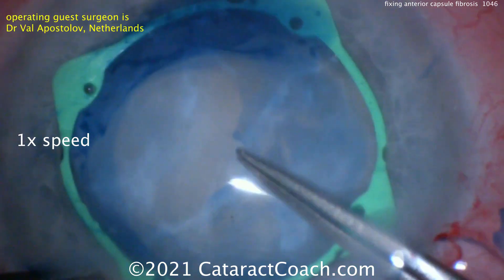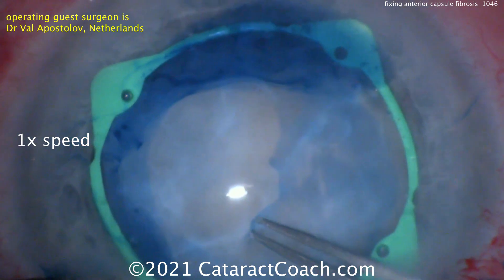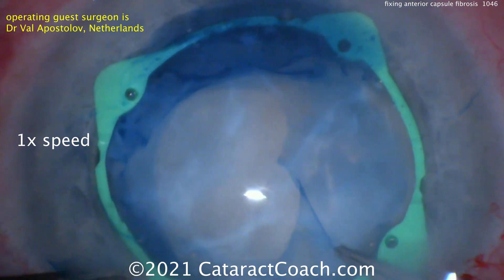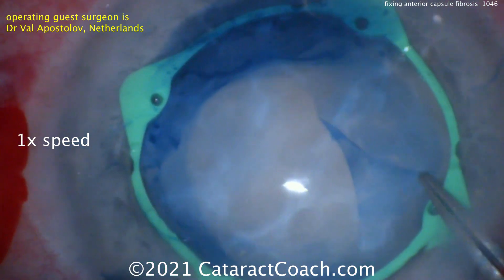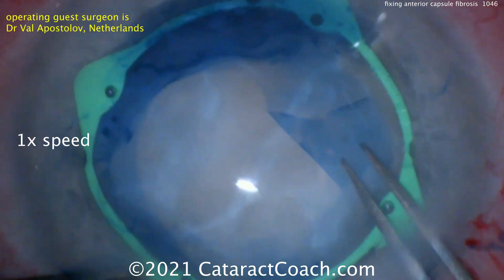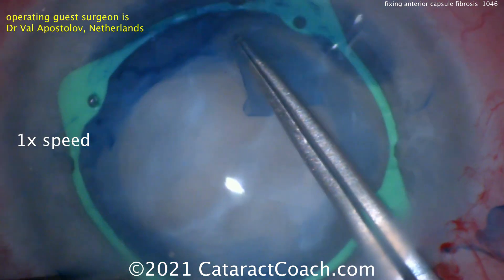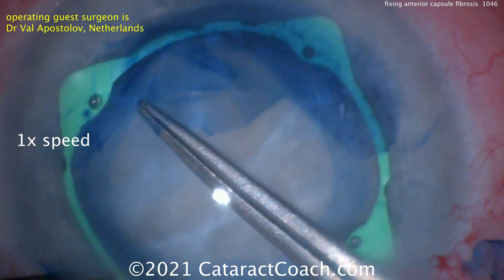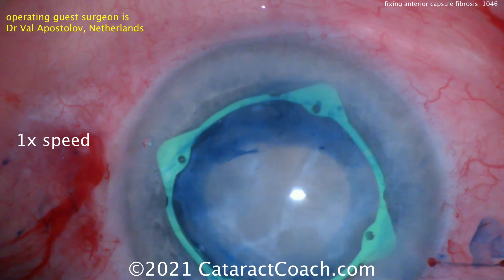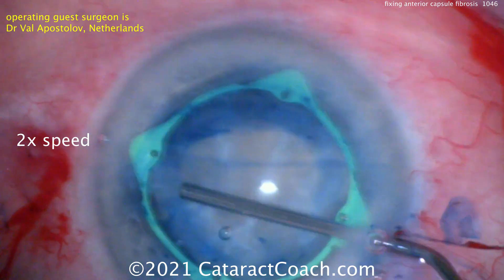The fibrotic tough material, which is all anterior cortical, is still there adhered to the rest of the cataract. That looks like a pretty reasonable rhexis — at least half of one — and the other half will be completed in the same way. Just taking his time to do a good job separating the capsule from the fibrotic area. His secret is starting centrally and moving peripherally. Now he can complete the rest of the rhexis, going around quite nicely, ending up with a beautiful five-millimeter rhexis.